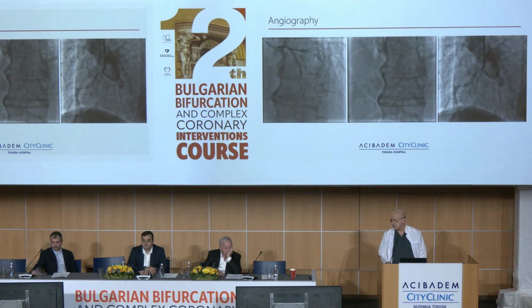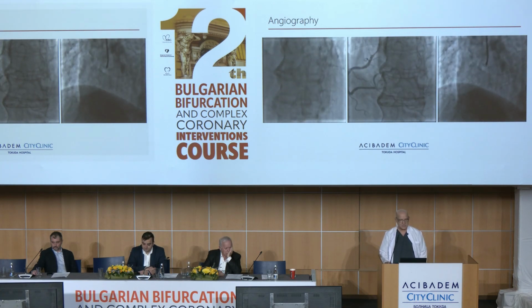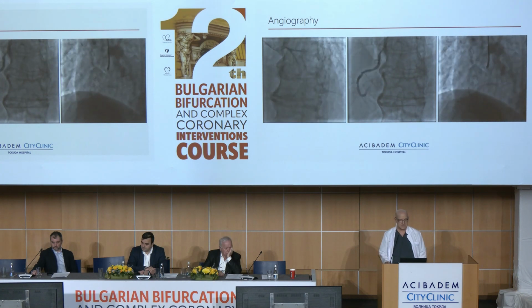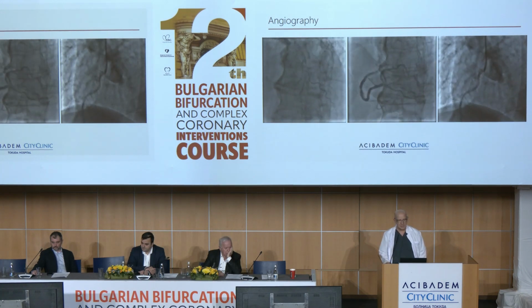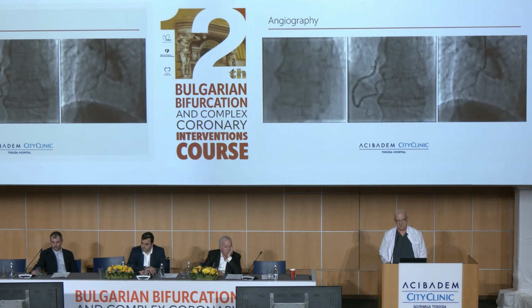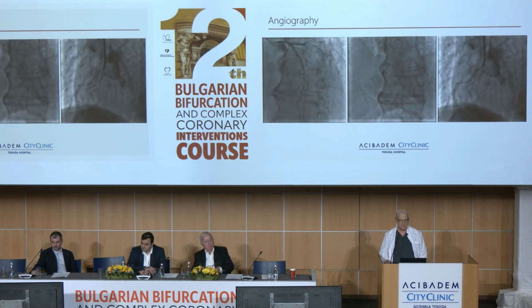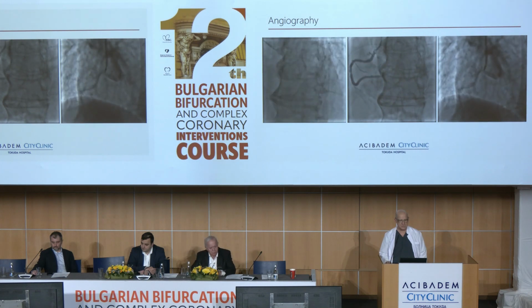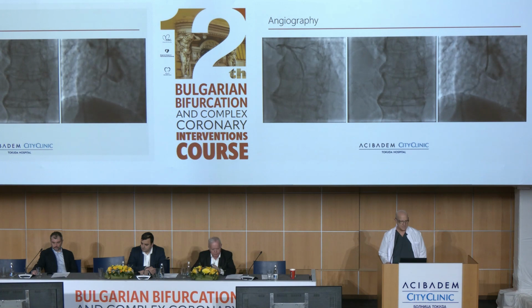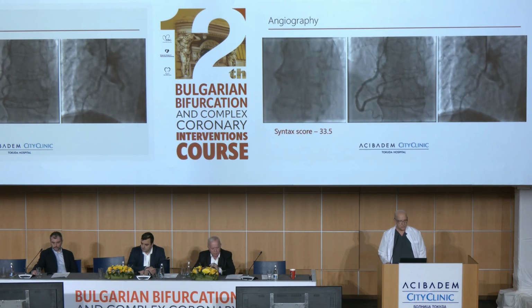And yesterday the patient presented with some chest pain, elevated troponins up to 1,500. And what we found on this right coronary is that the stenosis was, in my view, much more severe.